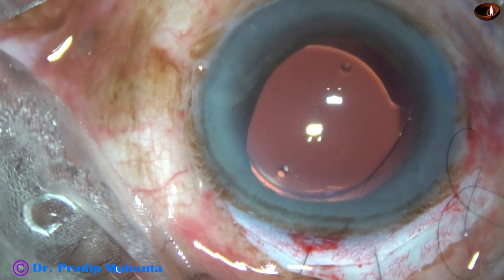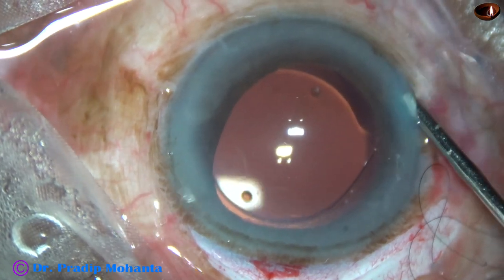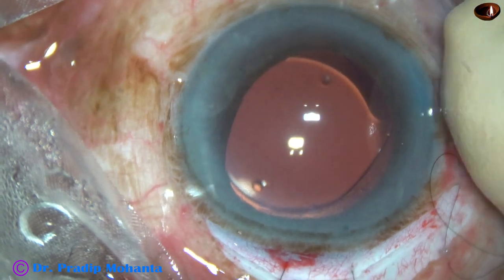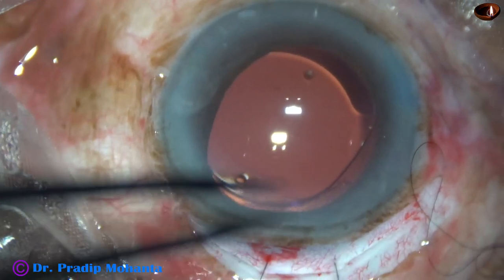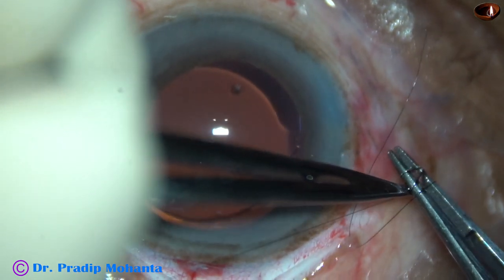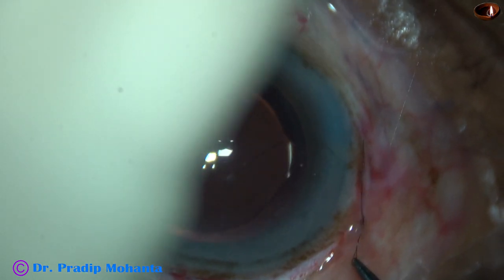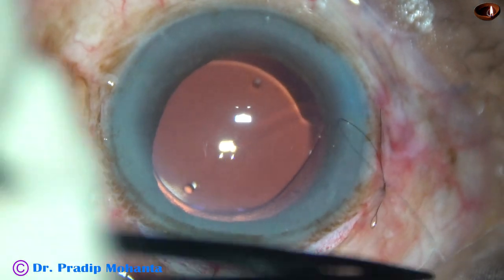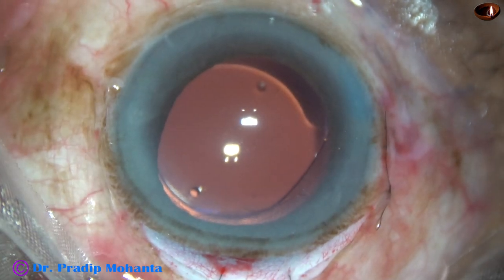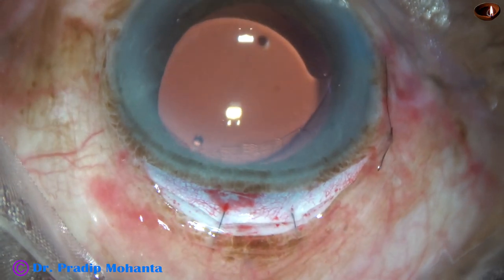The anterior chamber is formed, but I am going to form it in another way. This is the irrigating probe of bimanual IA — one stream goes inside, another one goes outside at the side port — and the anterior chamber is nicely formed. This is three loops: hold the thread and pull it — this is a releasable suture. Cut the longer thread very close to the knot. The other thread will be pulled at the outpatient department and it will come out.